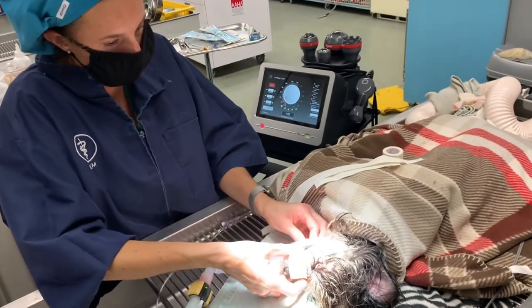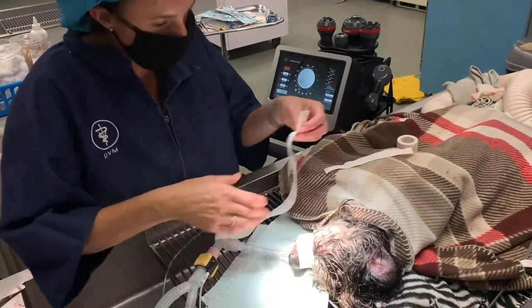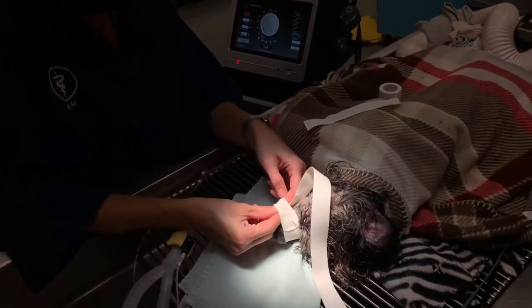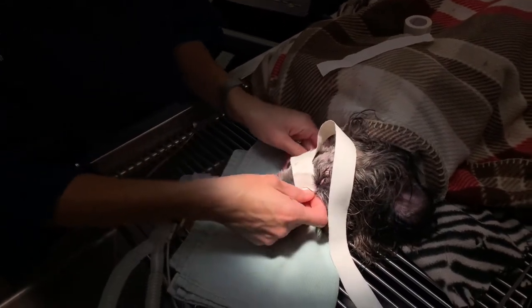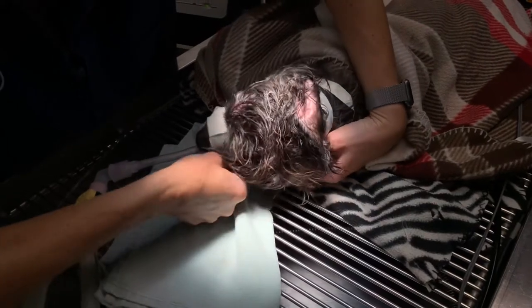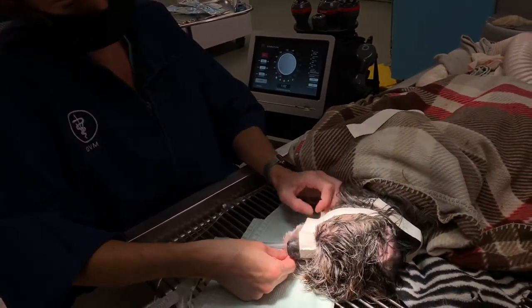It's a little bit of a pain still having all these tubes in, but at least this way the dog doesn't feel it. We did our therapy laser treatment already to the mouth to help with pain and inflammation, to try to get this kid feeling better. I mock it up and then reinforce it. So this is essentially what it's going to look like — we'll put some additional tape on here and have a nice little muzzle for this dog.